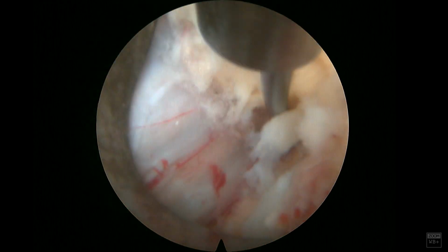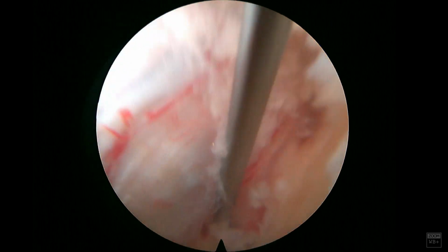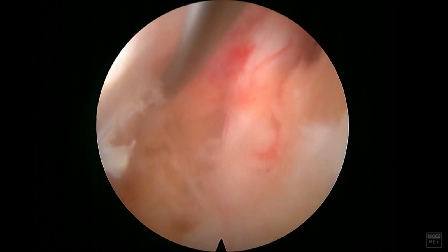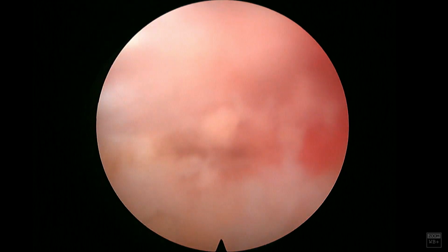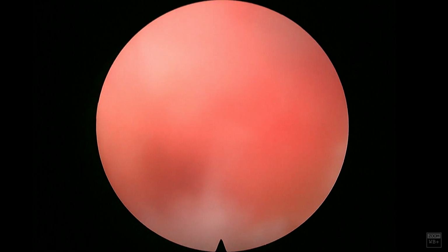anatomical spot to work in, especially when you have pars defects and spondylolisthesis. If you remember the MRI, the spondylolisthesis was greater than 4 or 5 millimeters, so we know that traversing nerve roots can be in a different anatomic position than they normally would be. And so, again, you want to control this bleeding fairly quickly, and I'll use the RF probe here in a minute to do that.